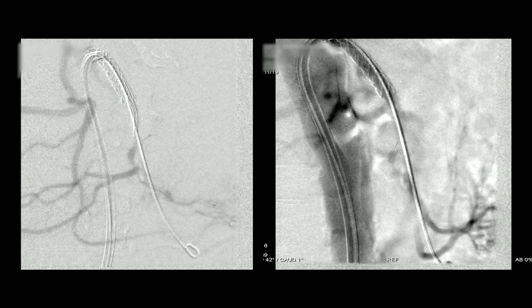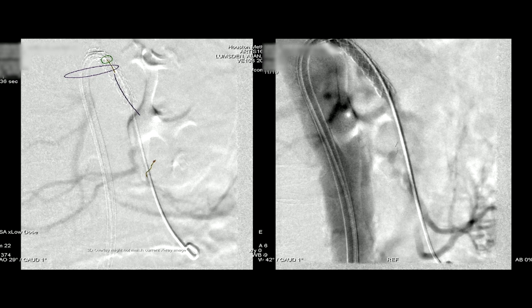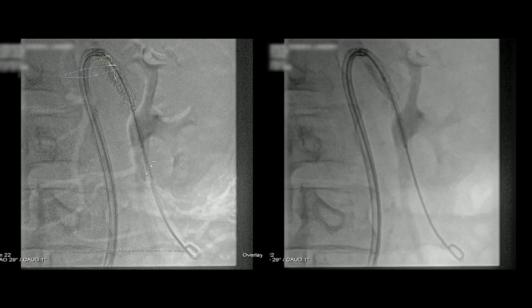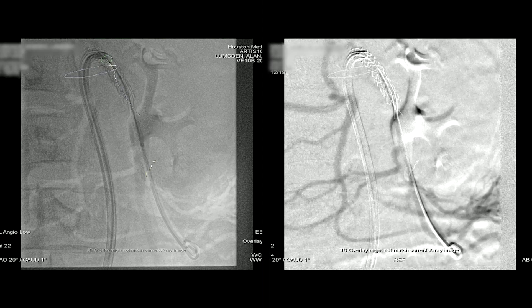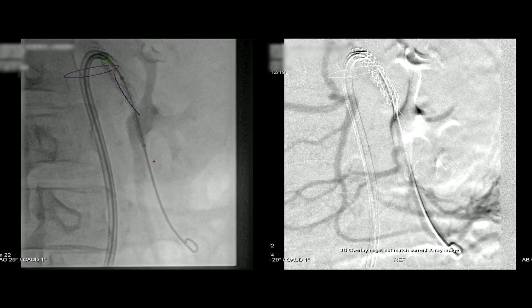Having identified that, you can see where the wire is in the main component of the SMA and where that branch is. Now we're going to bring the second VBX up — it tracks nicely through the first one. It's all about positioning the distal end; we don't really care how much overlap there is. Make sure you use stents that are long enough so that you don't need a third stent to bridge a gap. We're reasonably confident — you can see the fusion mark up there — but we're also looking at the angiography.